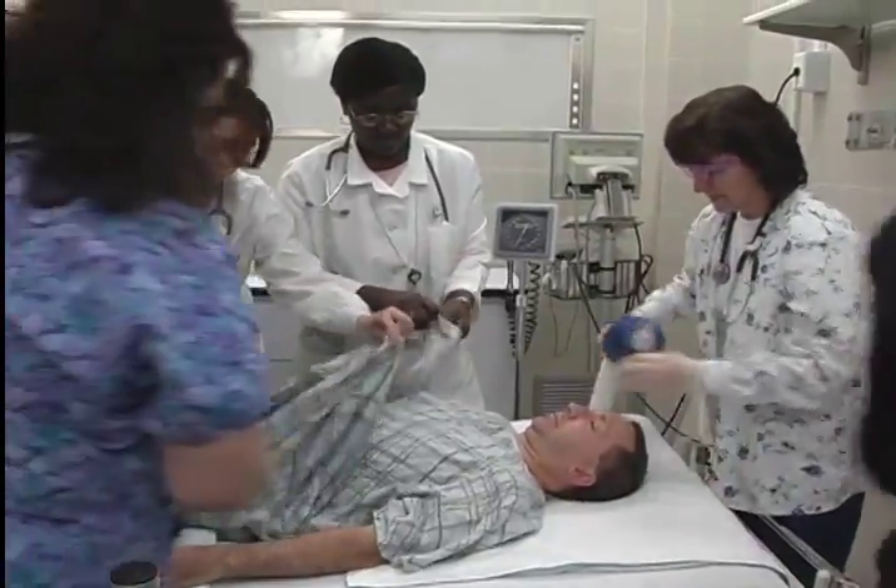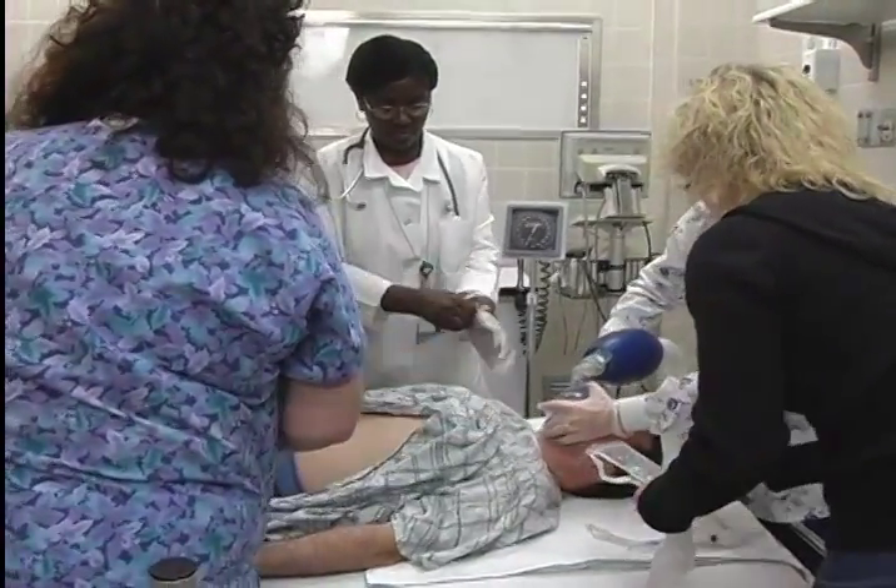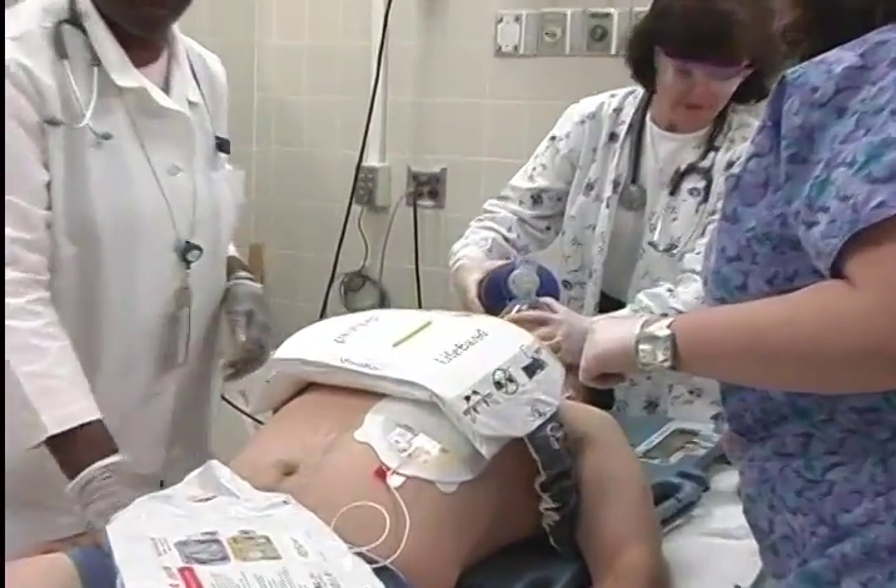In addition, it helps to minimize pauses, keeping no-flow time to a minimum. Each institution should determine how this model can be integrated into the typical roles performed by members of the resuscitation team. Practice as a team using this model will help streamline actions and ensure rapid and efficient deployment. The following is a hospital-specific pit crew type of deployment based on the protocol demonstrated earlier in the basic deployment section.